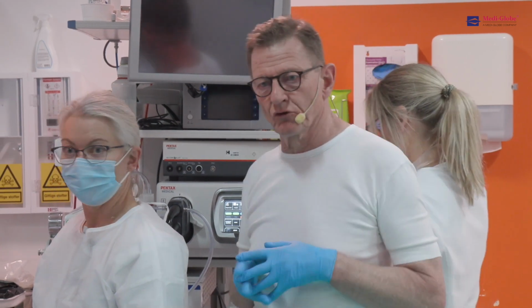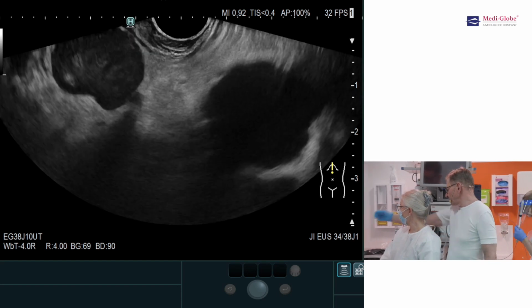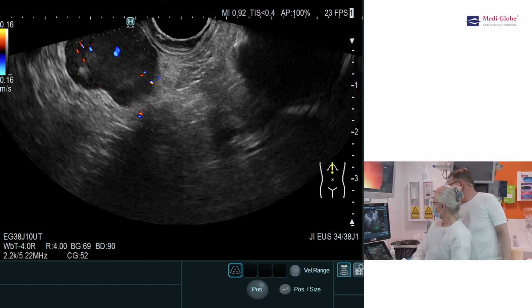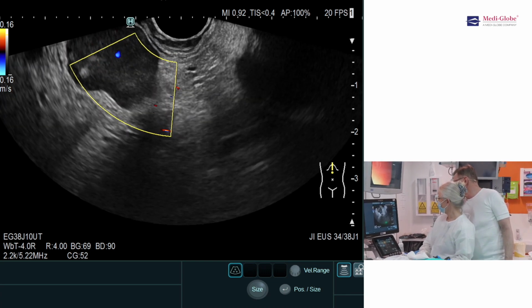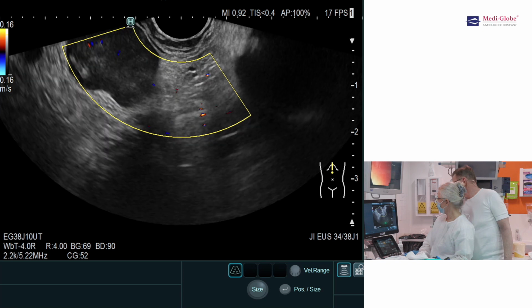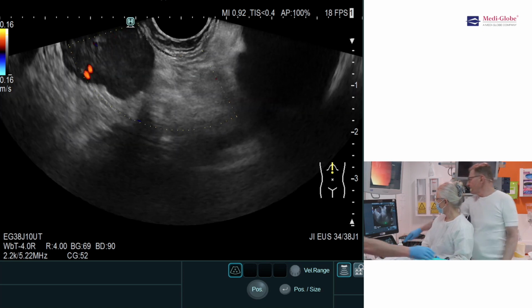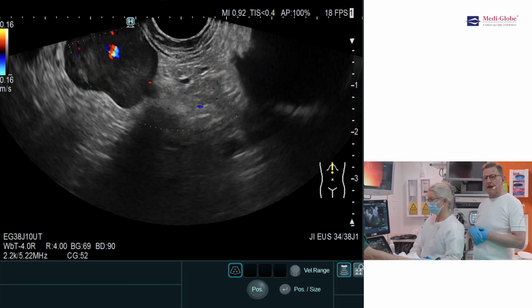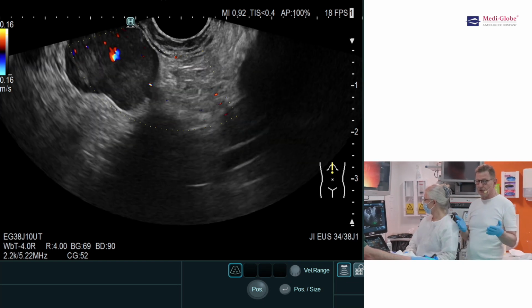If we can shift to the ultrasonic image, you can watch the lesion here, and we look at color Doppler, and it's actually also quite vascularized. Quite vascular. As you can see, there are some vessel signals inside. It might be a GIST tumor. It can be a neuroendocrine tumor.